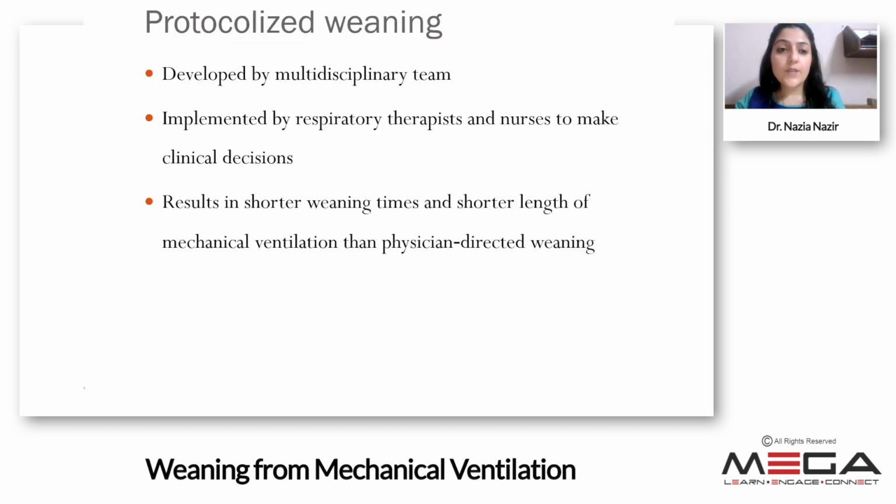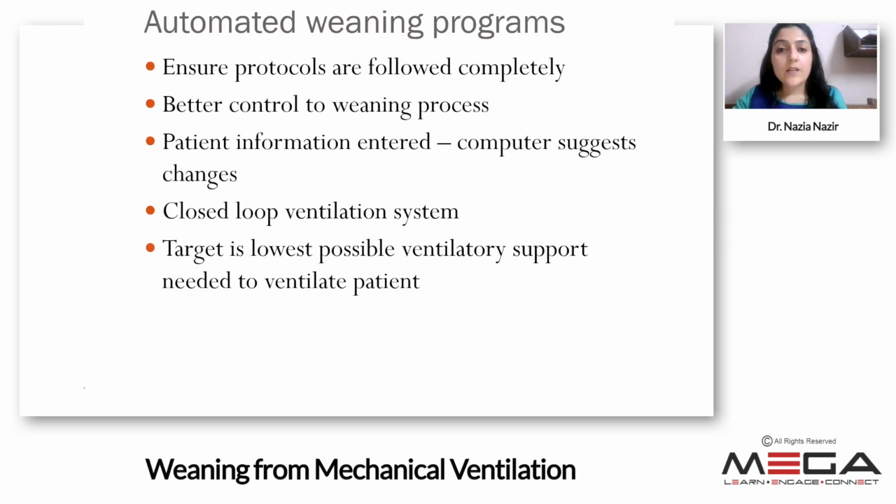Now, protocolized weaning is developed by multidisciplinary teams, and is implemented by respiratory therapists and nurses to make the clinical decisions. It has been seen that protocolized weaning results in shorter weaning times and shorter duration of mechanical ventilation than physician-directed weaning. Now, newer ventilators have some automated weaning programs. These automated weaning programs ensure that the protocols are completely followed and there is better control over the weaning process.